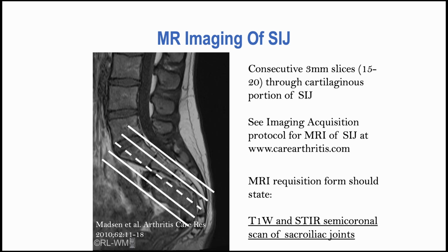It is important that the imaging is conducted in this manner because this allows the optimal depiction of the cartilaginous portion of the joint. If you would like to download the image acquisition protocol for appropriate diagnostic evaluation, this can be done from the Care Arthritis website.